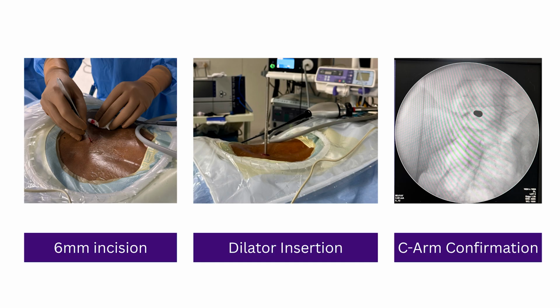Once you take the deep fascia cut, now it's time to put the dilator inside. Whether you are using the stenoscope or the discoscope, take the dilator and insert it inside perpendicularly. Do not try to angulate it medially or laterally, because you have already marked your incision in the middle of the interlaminar window in this particular case. So try to insert the dilator perpendicularly inside. Do not try to poke it.